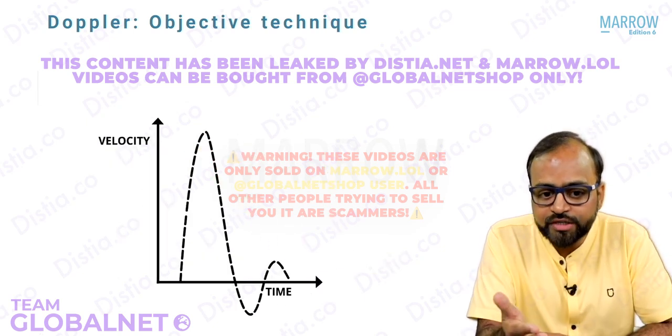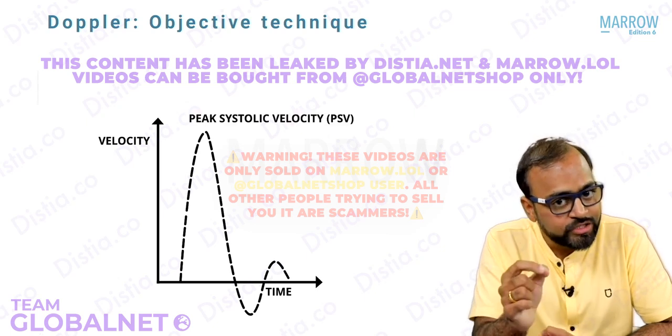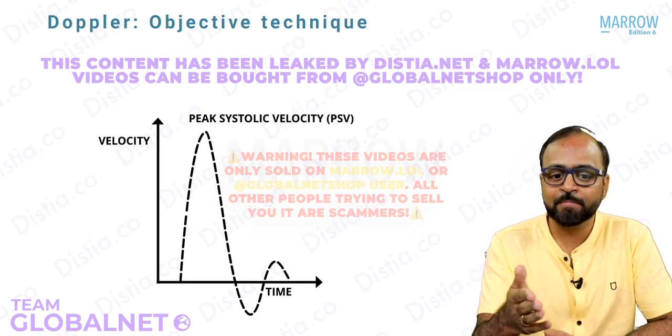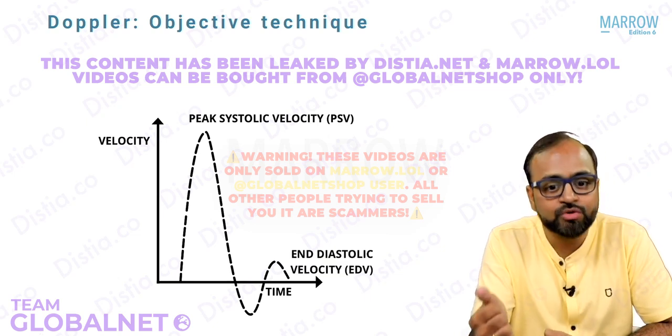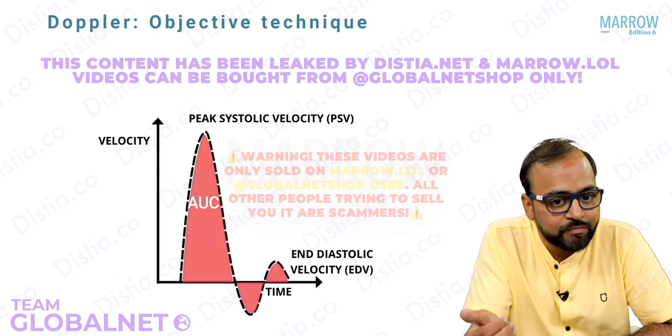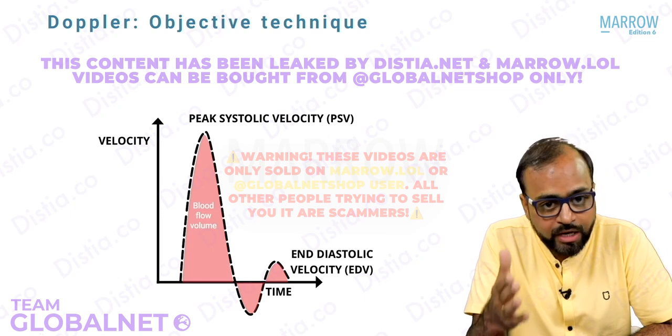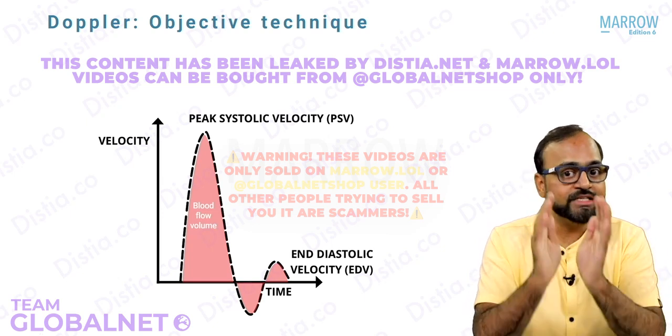Just look at this velocity against time graph. If you pick up the highest point, that is the highest velocity, it is called peak systolic velocity. Just look at the lowest point, that is called end diastolic velocity. If we calculate the area under the curve, that will give us the blood flow volume to a particular organ. So now, using this graph, are you able to measure the blood flow?